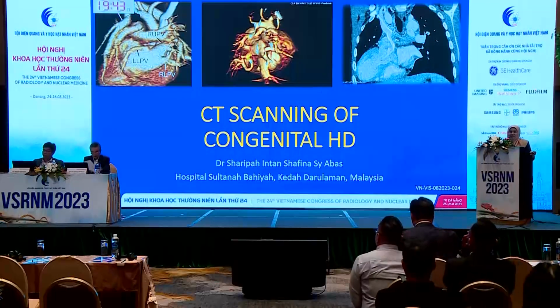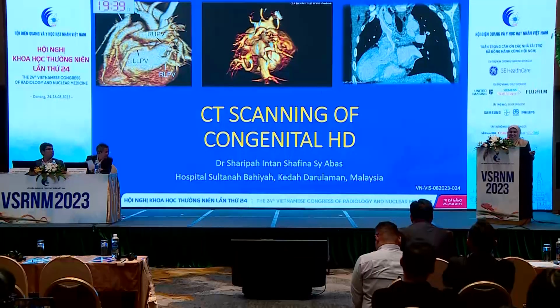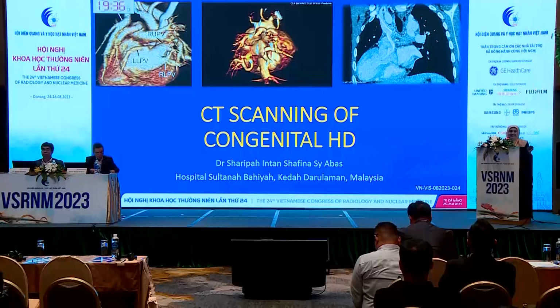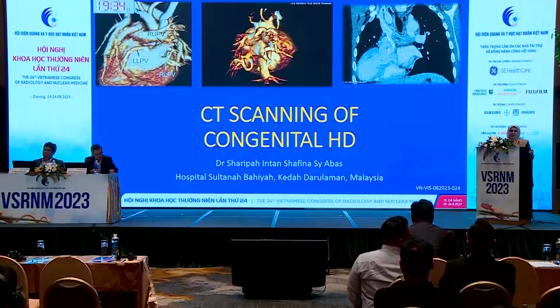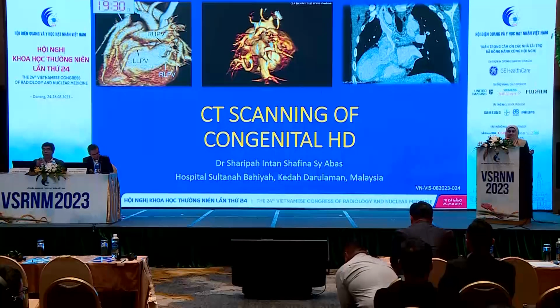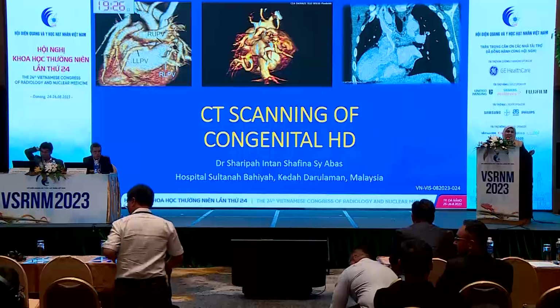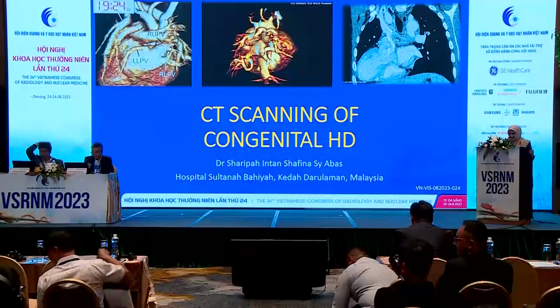So after Prof. Wally's mind-blowing research just now, now it's a more relaxed session, I think. More of anatomy, because I'm not sure among the crowd how many are really interested in doing congenital CT scans, especially in congenital heart disease.